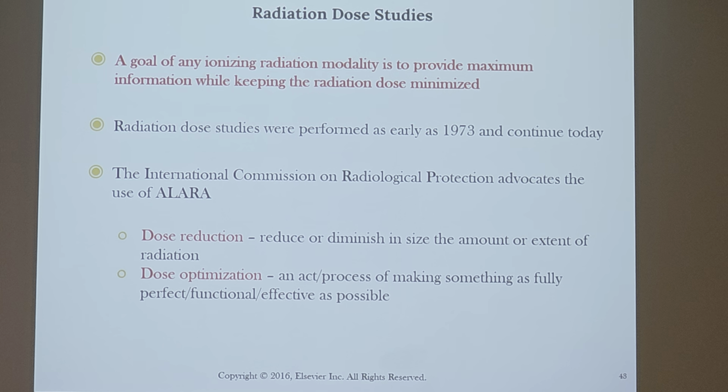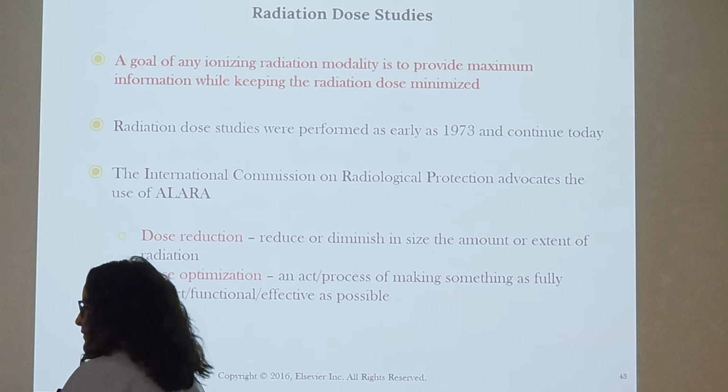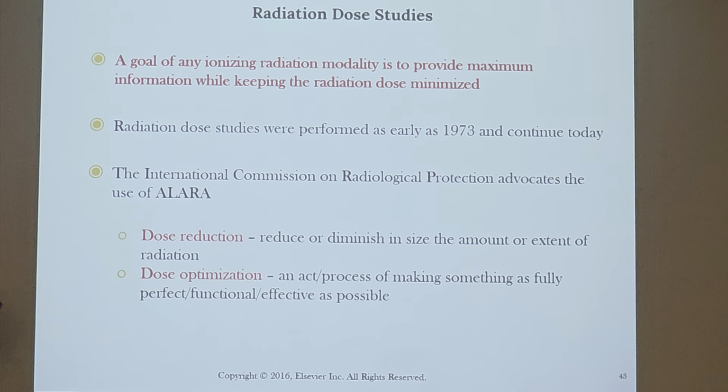So that being said, remember the rule about X-ray energy dissipating? When you walk into an X-ray room, who holds the radiation? The patient. Walk slower. Give it a few seconds before you get there. Let that Compton radiation scatter out of the way.